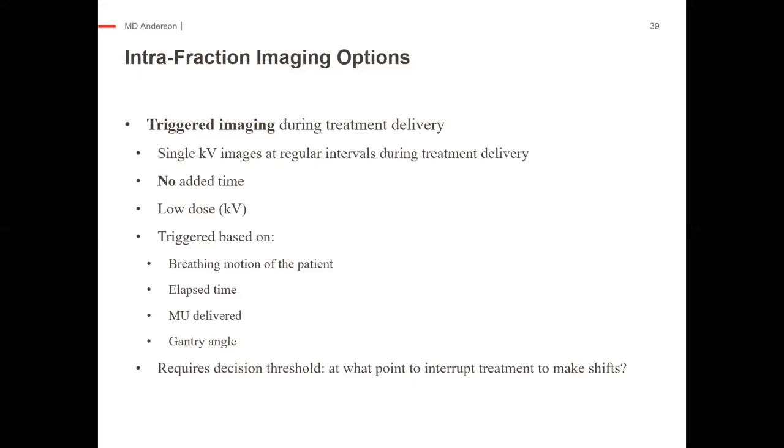You could take it with every elapsed time. So you could say every 10 seconds, take a KV. You could do it with MUs delivered. So every 100 MUs or whatever you would find clinically relevant, or every gantry angle, so like every 10 degrees.